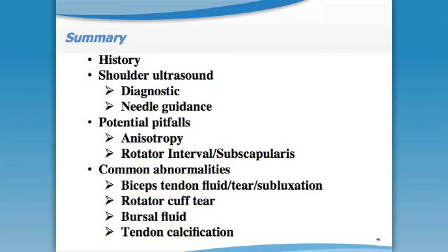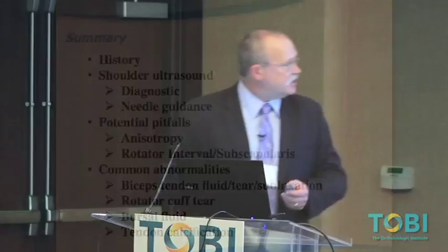So, thank you for your attention to all of this. Hopefully we've covered some of the history of shoulder ultrasound, where it came from, pitfalls, common abnormalities, and we'll proceed now with a demonstration of what constitutes a complete shoulder ultrasound study.